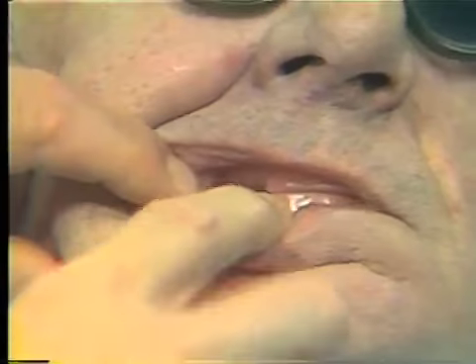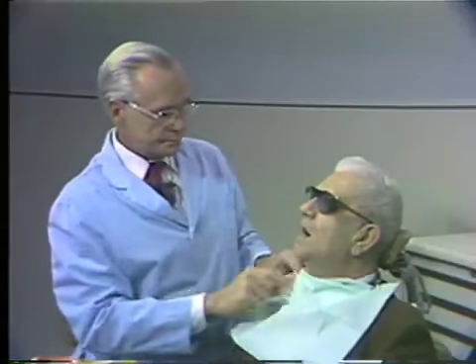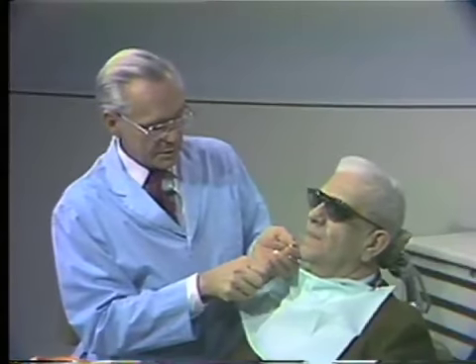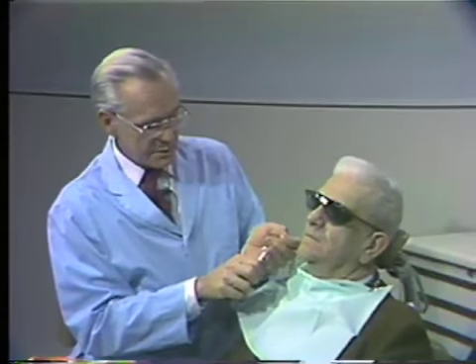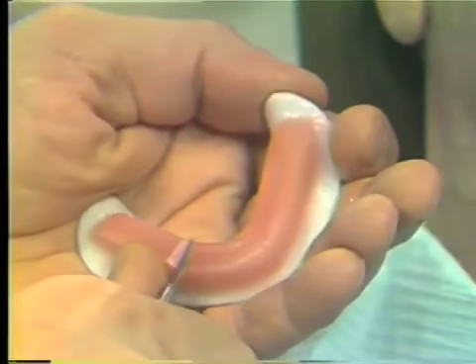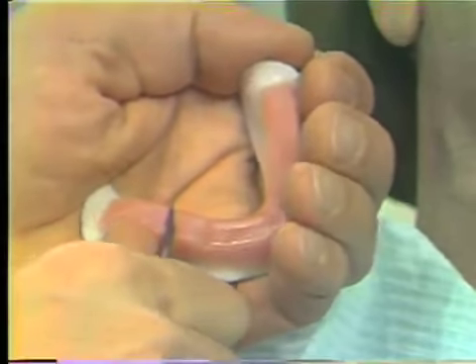Now bite together, Mr. Monahan. You see this space is wide open. This is where we'll place our soft wax. Now, opposing that soft wax, we'll make some grooves in the lower wax rim. Now, open again. We have the lower. With our knife, we'll make a couple distinct, not deep, only about 1 millimeter deep, but distinct, sharp, V-shaped grooves on either side.